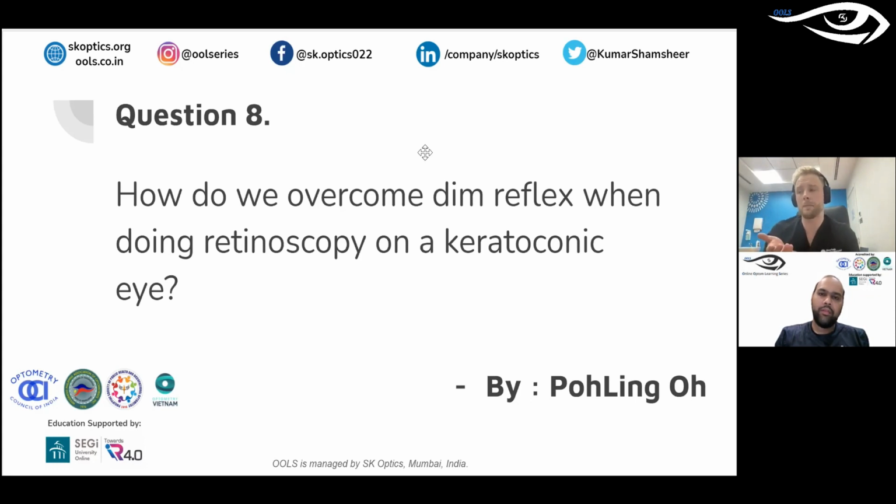The other thing is that if you're using the more peripheral pupillary reflex, you'll get better results, because keratoconus generally tends to be worse in the central 1 to 2 millimeter cornea. But if you can look just outside that, you might think, whatever it's doing in the center, the outside's all going with it, so I need to add more plus, or the outside's giving me a big cylinder in this axis. So try not to use that strict apical center. Try and look slightly off as well and go a bit closer, and you'll get better results, and lots of practice. That's the other thing.